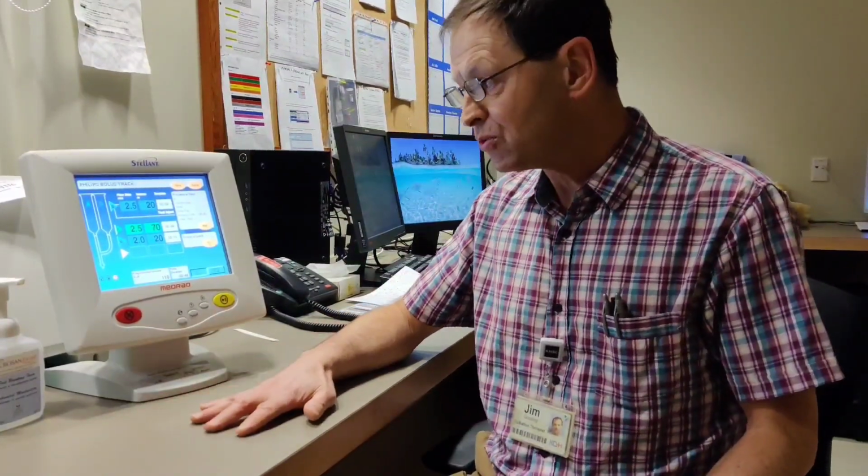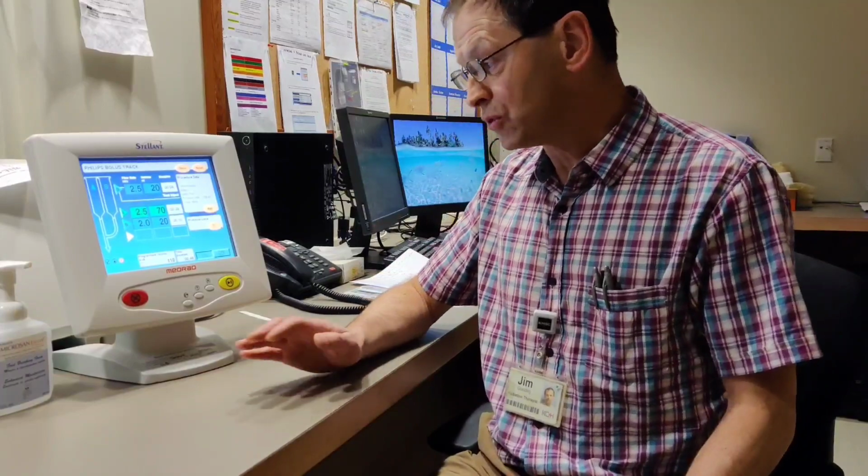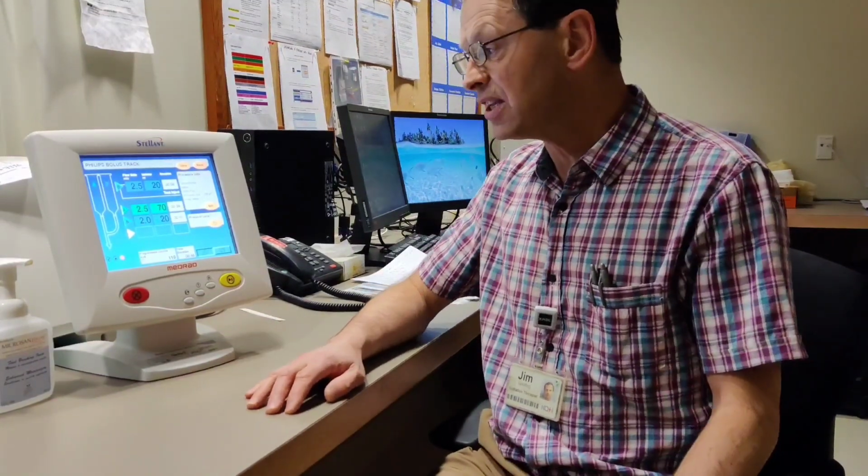And then once you're done with all your pre-programming and you proceed with the procedure, the actual contrast injection for Philips bolus tracking for those ENT patients would be 70 mils of contrast, again at a flow rate of 2.5 milliliters per second, followed by a final saline flush of 20 mils of saline at a slightly slower rate of 2 milliliters per second. At that point, you should be done the scan and the patient could be sent back to RadPro.